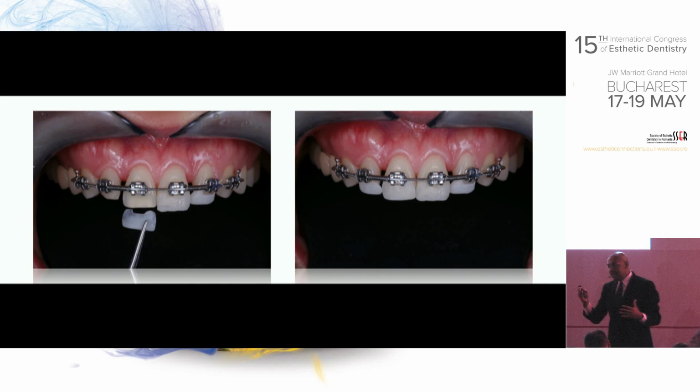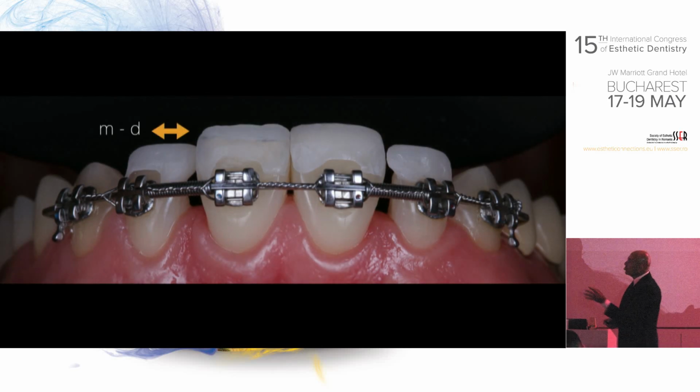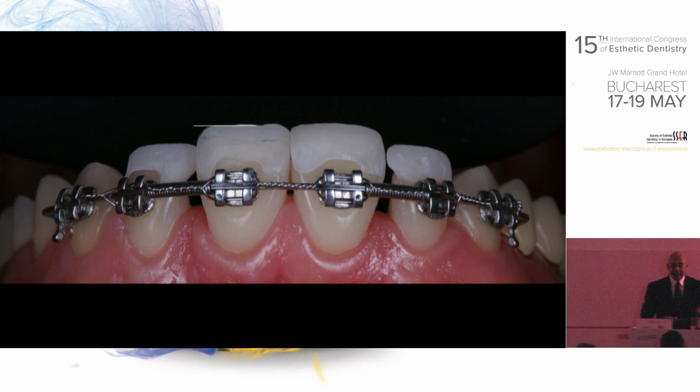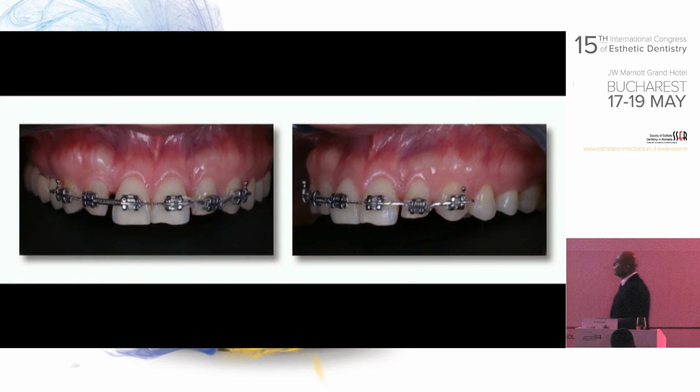So the teeth are not in the ideal position, but the silhouette of the smile is in the ideal position. So now Nuno will follow this to decide whether to move the lateral mesiodistally, or bring it buccolingually front or back, and I will also decide prosthetically the amount of incisal porcelain that I'll be layering on the incisal edge, and accordingly depend on whether to vertically move the tooth or not.